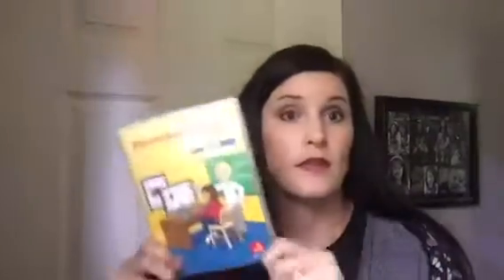Then as Melanie continued to grow, we expanded that, and she even used a few other things brought in by speech therapists, some little machines that had buttons with the Boardmaker pictures so that she could identify her choice. So we experimented with several different things along those lines, again continuing to use the Boardmaker software.